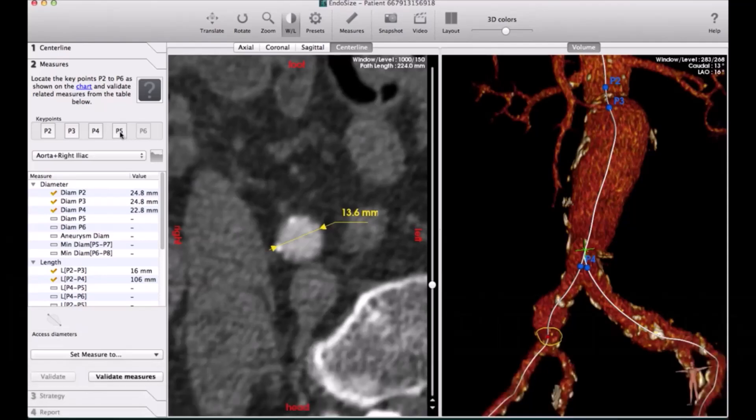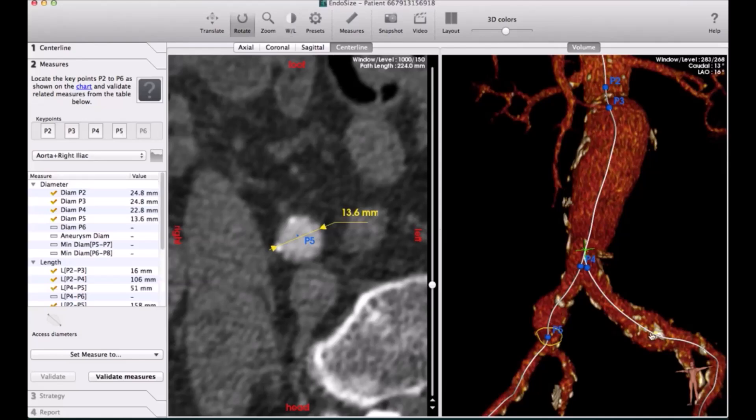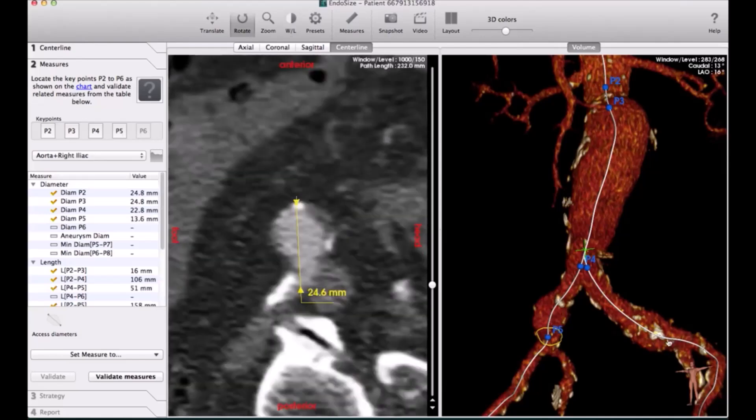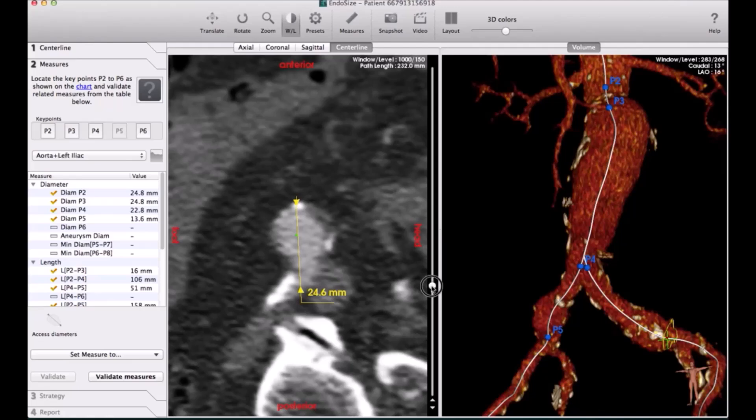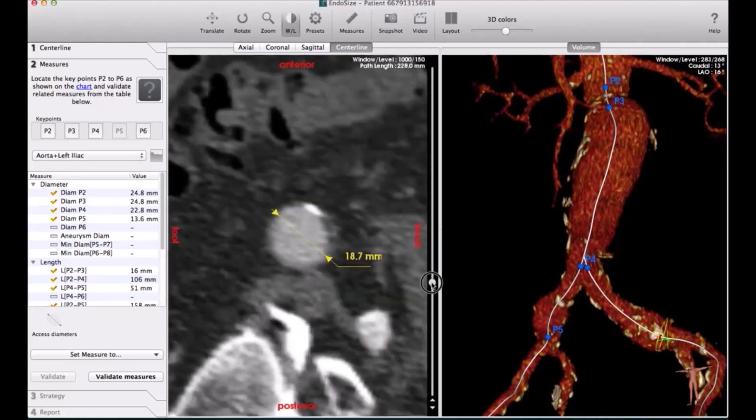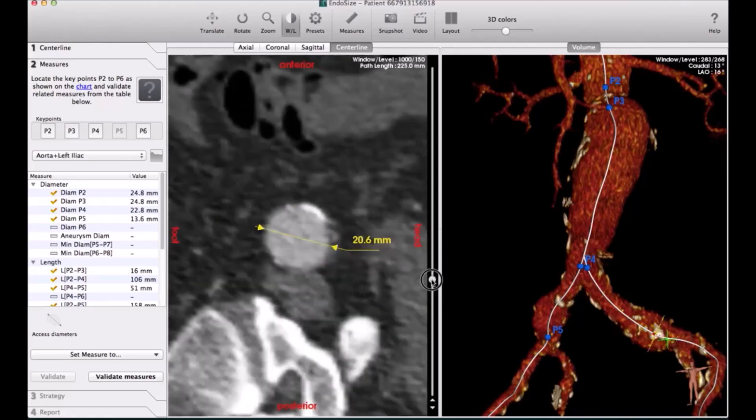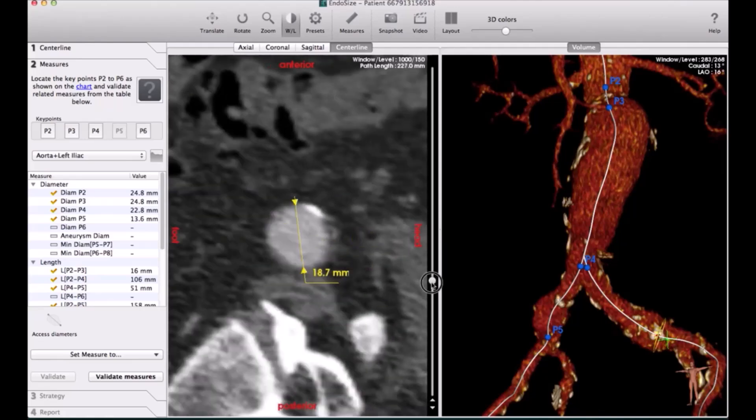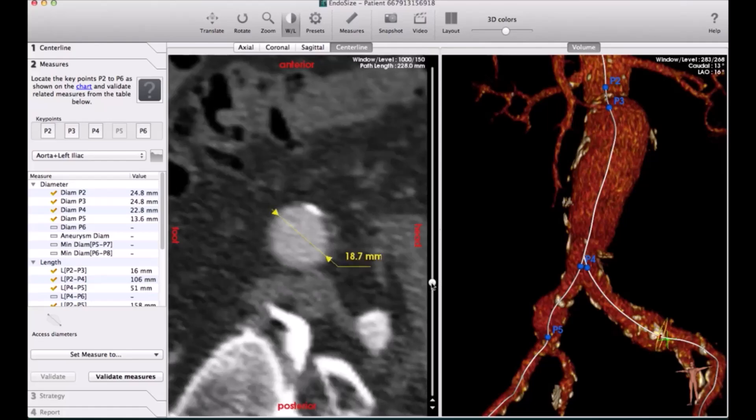The program also has all the common international devices: Cook, Medtronic, Cordis, Incraft. All the devices that you are using will be down there.